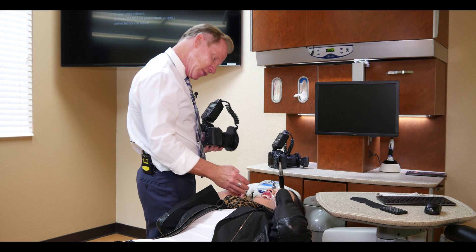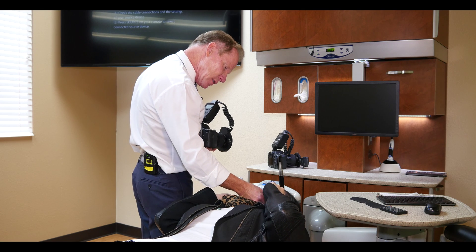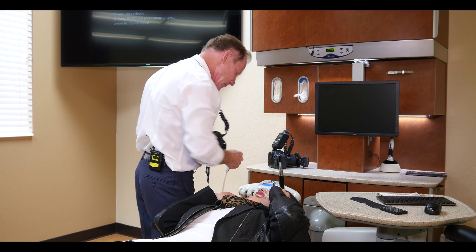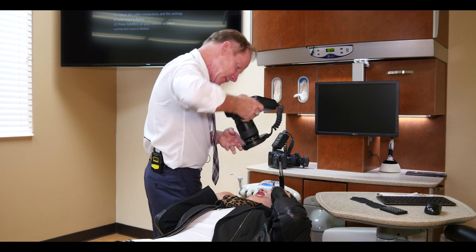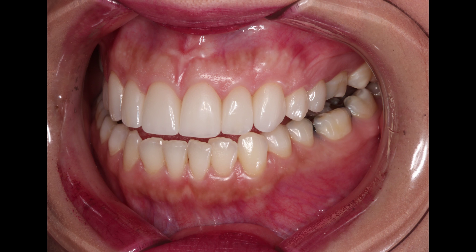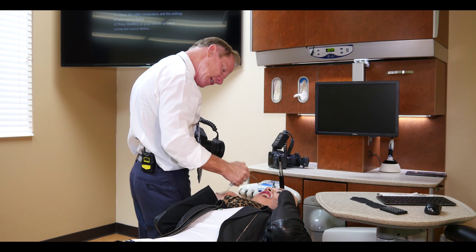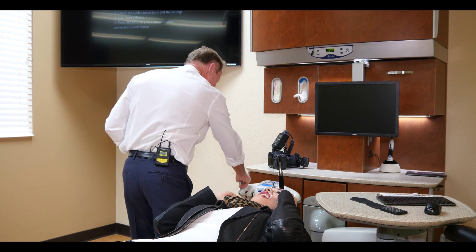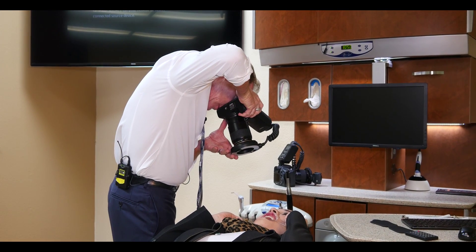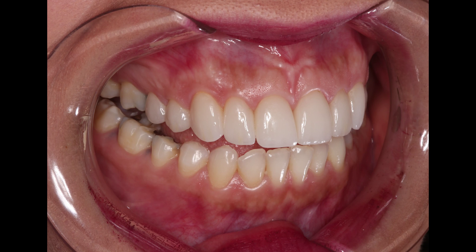Now we're going to take a left lateral view retracted. Turn toward me — relax this side and pull the other side back as far as you can against your cheek. Close down a little bit. Big smile. Now let's take the right side — turn to your left. Relax this side, pull the other back as far as you can. None of my settings have changed except for the magnification or ratio. Close down just a little bit.